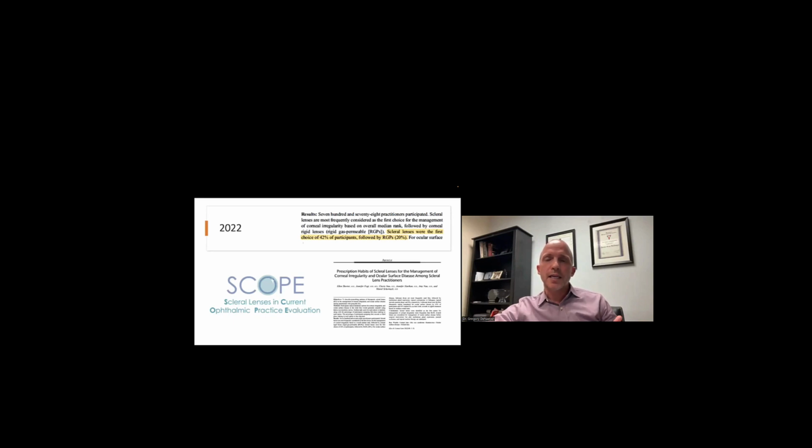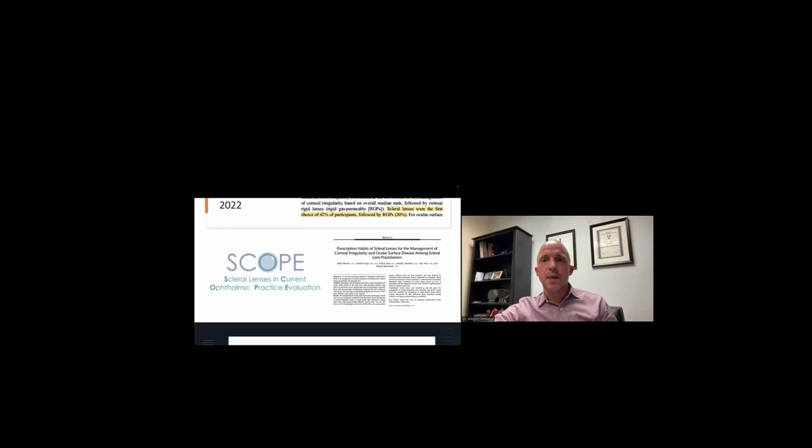And the increased use of scleral contact lenses undoubtedly has helped many, many patients improve their quality of life. But we are also seeing that it's affecting the number of transplants that are done. And this is a study that was published by Dr. Karina Koppen, who's a Belgian ophthalmologist. What they looked at was the severe keratoconus patients in their practice.